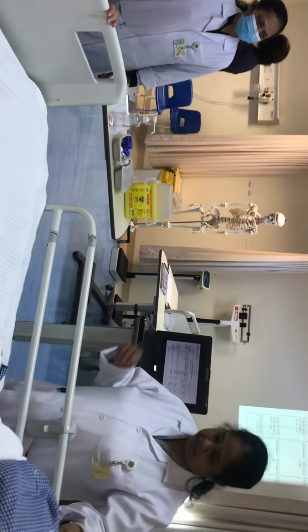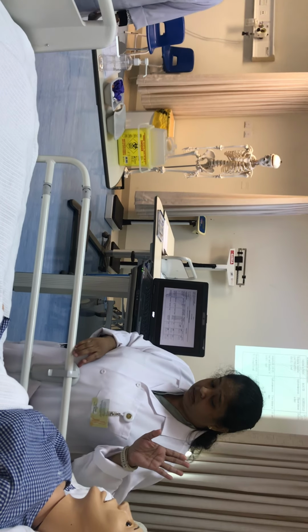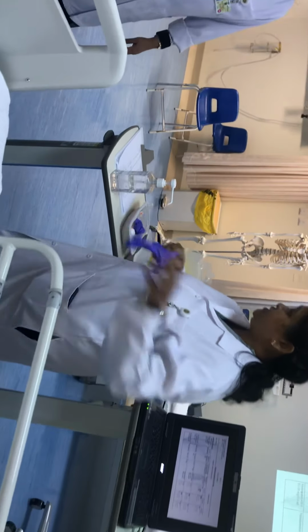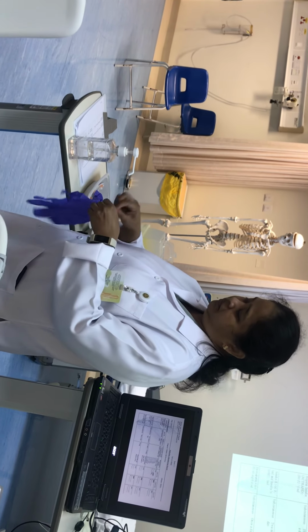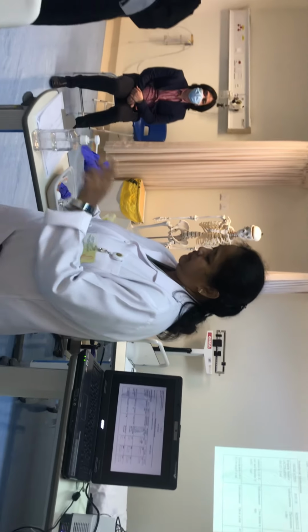Okay, sir, I have come back. So say all those things. Then re-identify. You are getting ready with your medications. You can wear your gloves now. At this stage also you can do the position, no problem. It's not wrong. If you forget in the first one, you do the position now, just to not waste time.